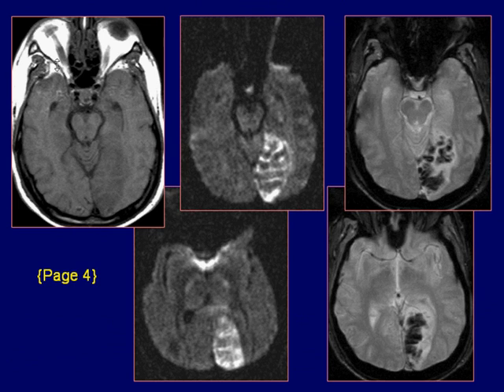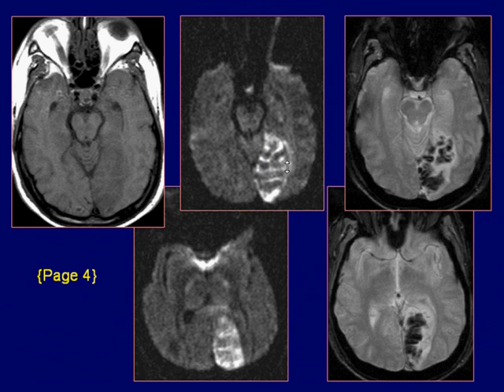T1-weighted image demonstrates mildly hypointense gray-white matter in the left occipital lobe. Diffusion-weighted images demonstrate restricted diffusion in the left occipital lobe.